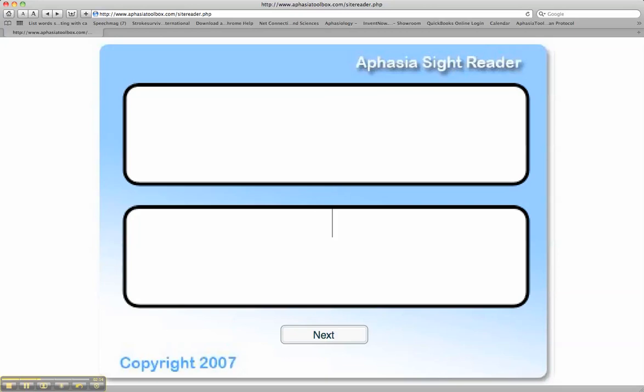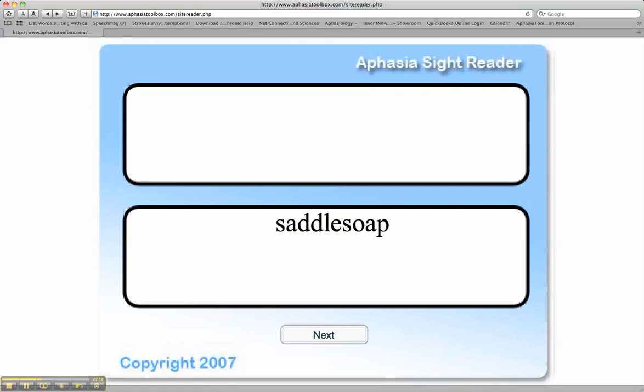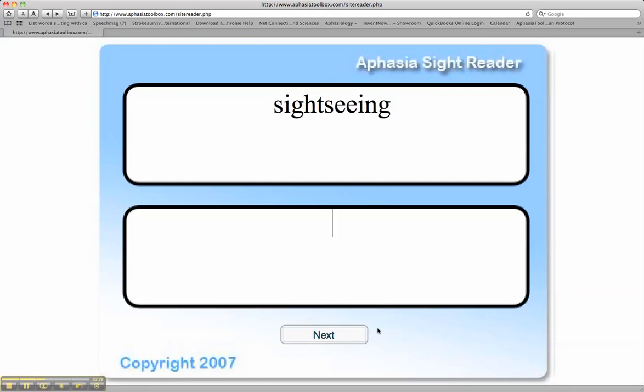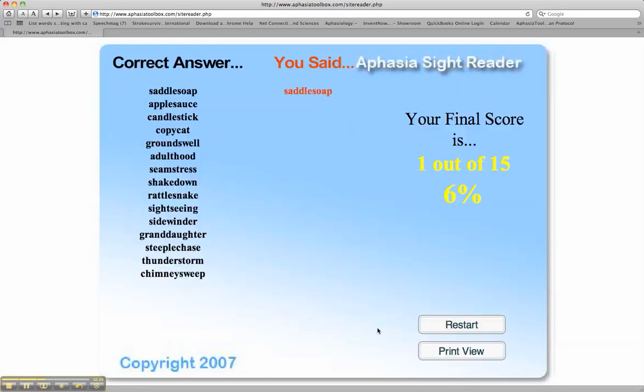Say the first word, saddle, and type it. Say the second word, soap, and type it. Again, breaking the compound word into two words, working on working memory and spelling memory, and we have the final summary.